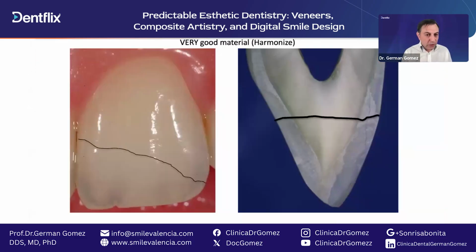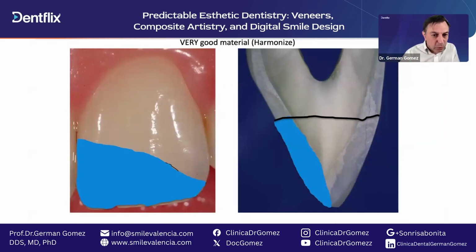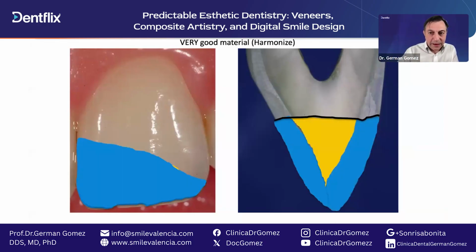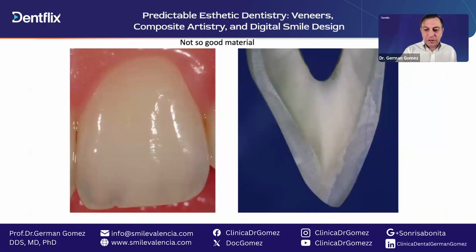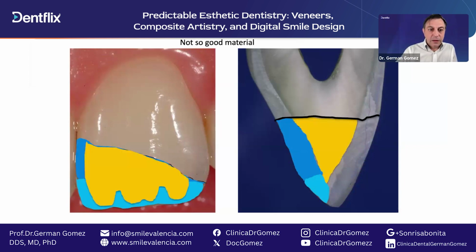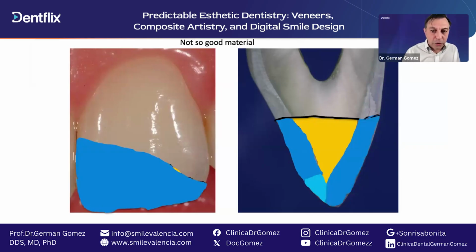Okay, good. How do we do the layers from the back to the front? Well, it depends on what material we have. If we have a good material, we can do only 3 layers, which is the enamel on the back, then dentin in the middle, and then enamel in the front. Usually that is enough. So more sophisticated should be enamel and then transparent composite on the back, then dentin, and then in the front we have enamel.